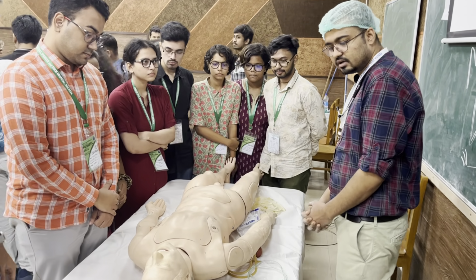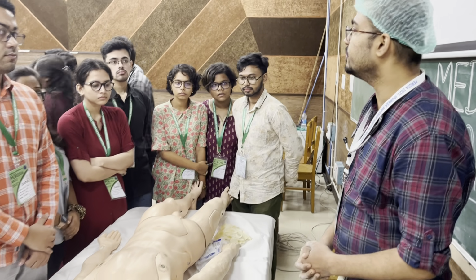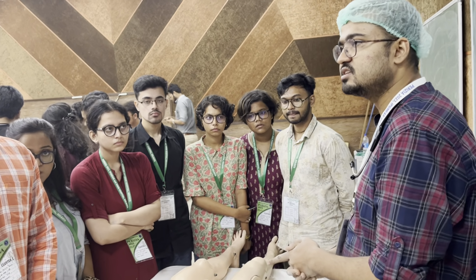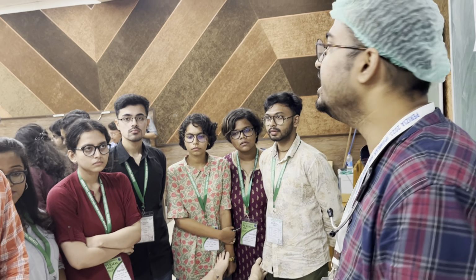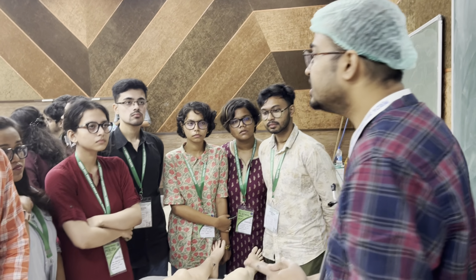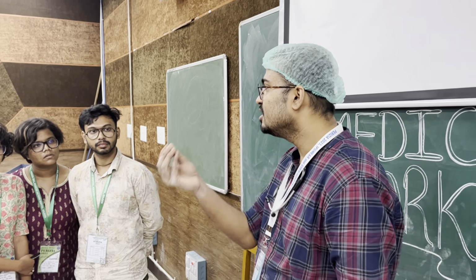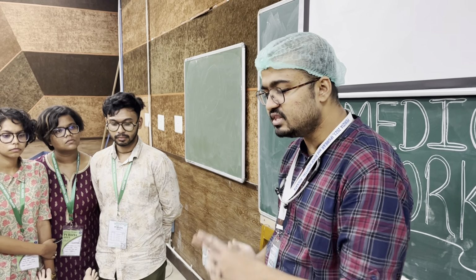So now I am going to demonstrate the procedure of Ryle's tube insertion, or nasogastric tube insertion. Okay, so what are the indications of nasogastric tube insertion? When the patient needs enteral feeding, but the patient is unconscious and cannot take food by their own choice, then we have to insert a tube so that we can feed the patient.